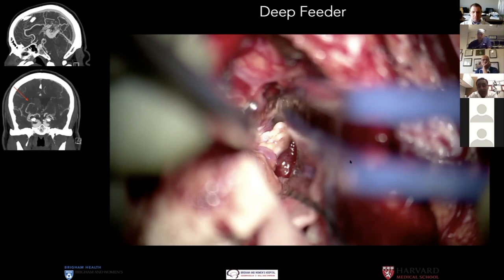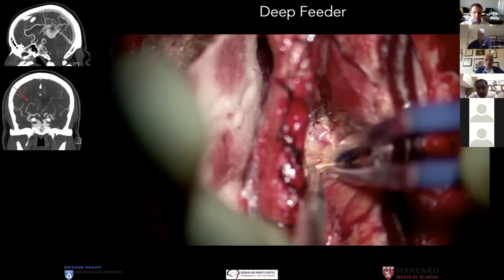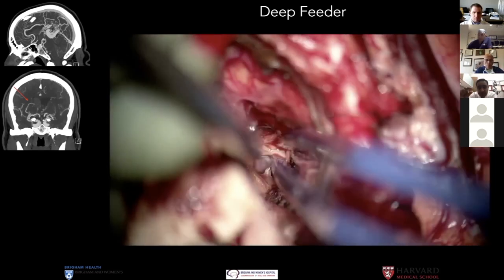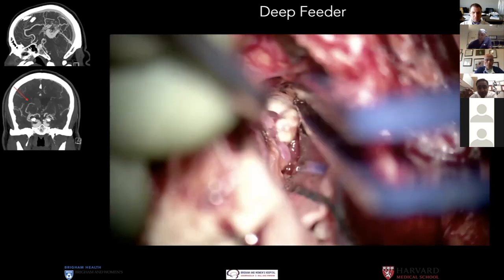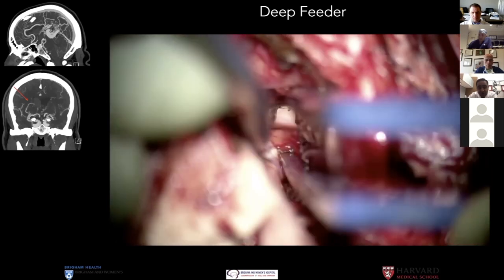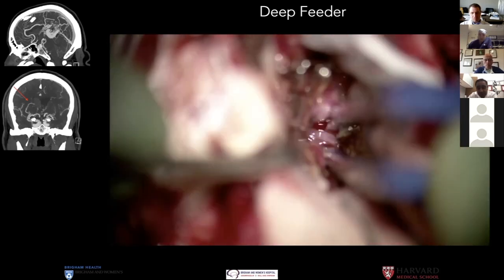See, before I've removed the AVM, we haven't removed it, we're able to get to it right there. You see, we made a beeline the size of a patty, a half by three. There's a ventricle. I'm going to show you the artery. There it is. Now you see the color is more salmon color.